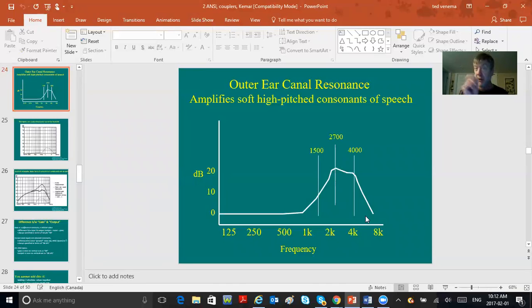Okay, it should be really close. You don't have to boop, hit the eardrum. That kind of hurts. But ensure that it's very close, and you will learn in your labs how to do that. But for now, the main purpose today of using this is to ensure that you're still getting a bump at 4,000 hertz. And that tells you, yep, I'm close to the guy's drum.